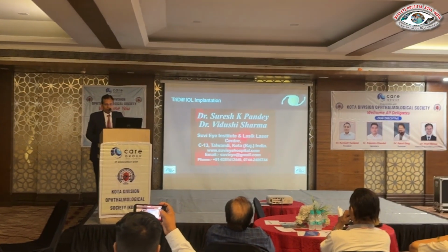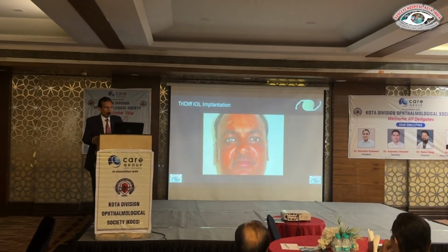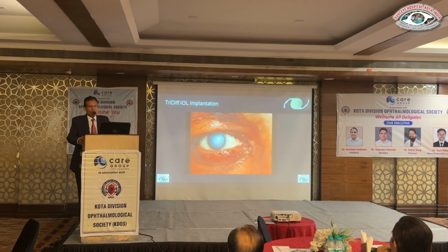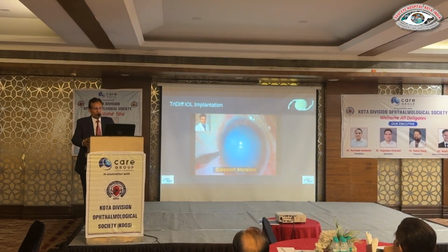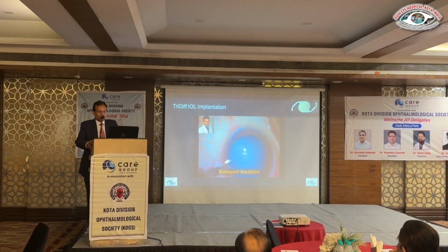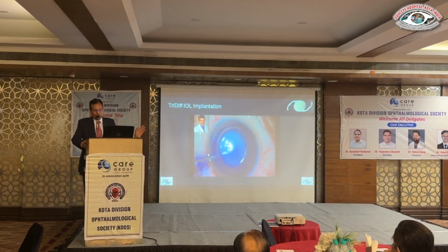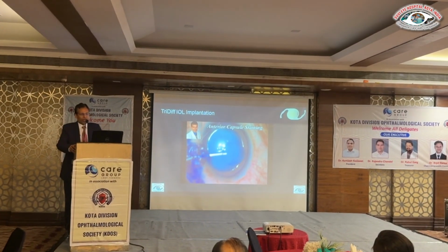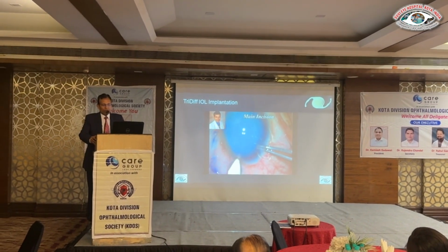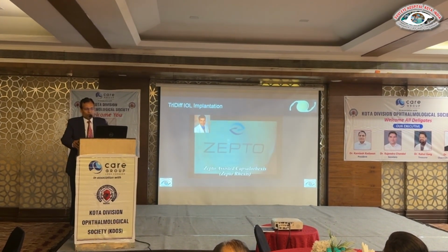implantation. Dr. Sanjay very nicely shared the video, and this is a case of a 38-year-old lawyer who came to us, and this was the first case where we did the TriDiff lens implantation using the Zepto nanopulse technology. So this was a young lawyer, and he was very keen on getting the perfect lens with minimal or no dependence on the glasses. So the surgery was done under topical anesthesia.